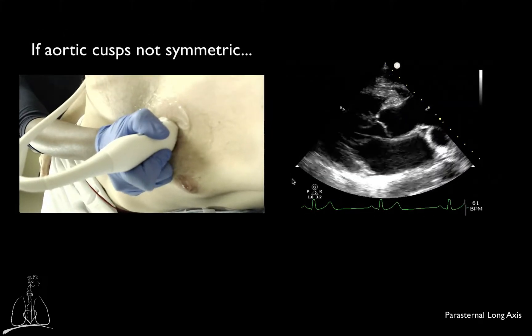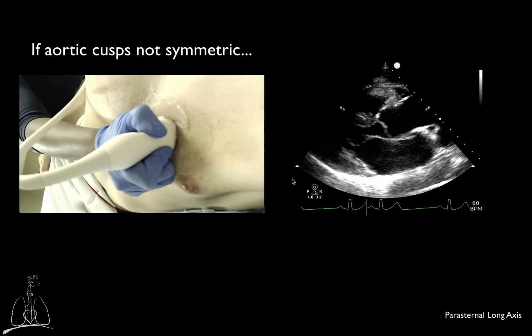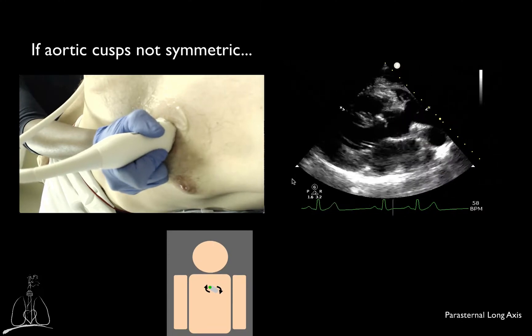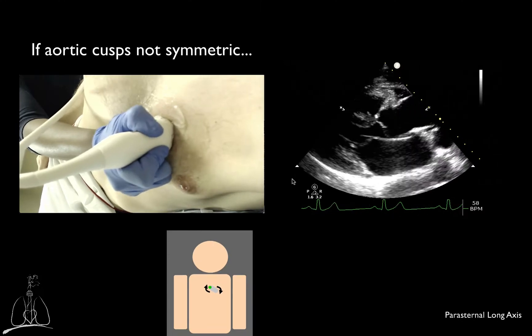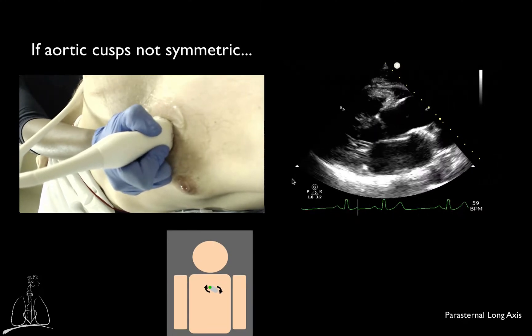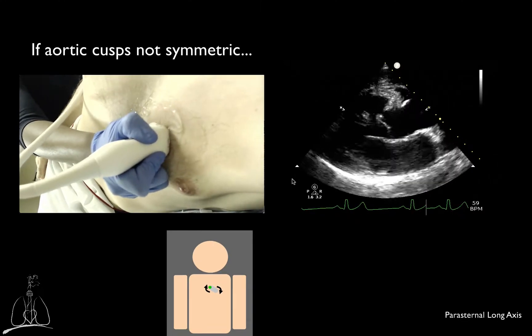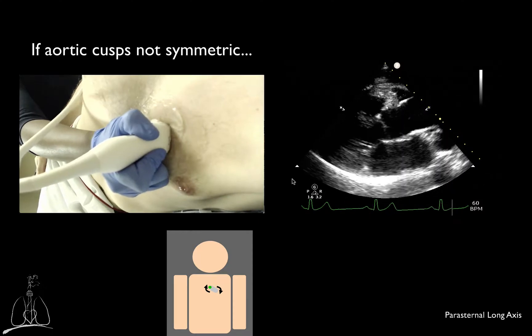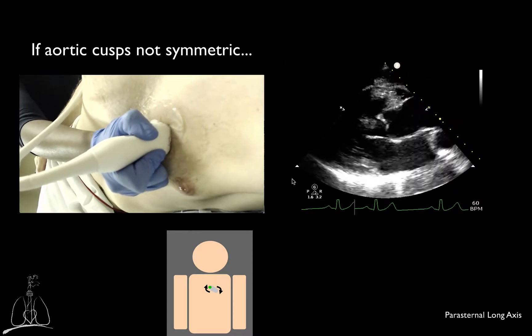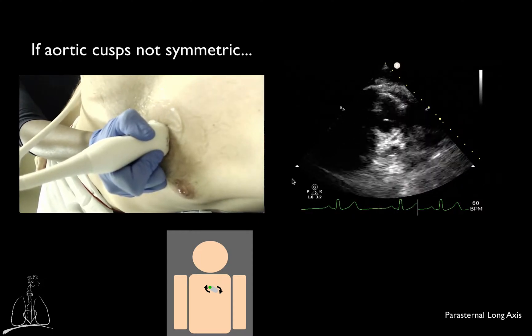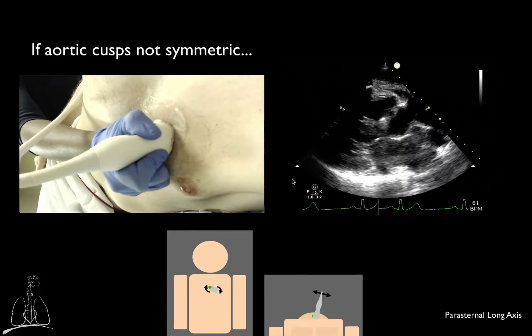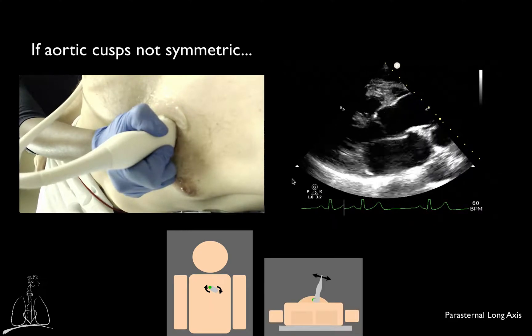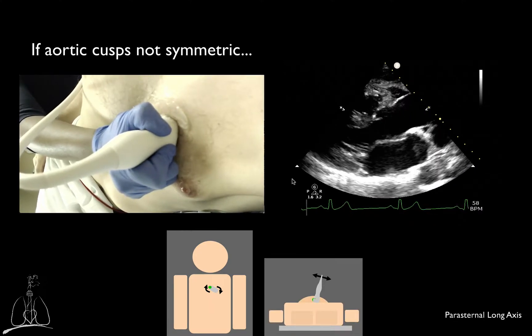If the aortic cusps do not appear symmetric, a slight rotation of the transducer should be performed in either direction. If rotating the transducer is insufficient to optimize visualization of aortic cusps, tilting the tail of the probe in either direction may help.